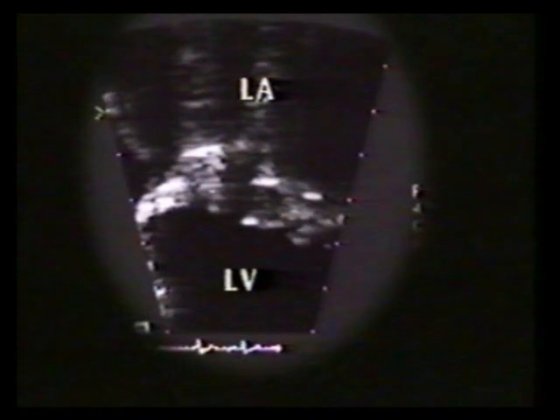We are now using the regional expansion system to more clearly visualize the motion of the discs. In this diastolic frame, the discs are fully opened. In real time, you will notice that the lateral disc closes slightly before the medial disc during several cardiac cycles.